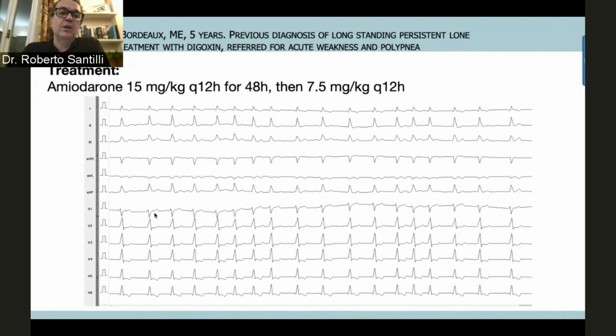So in this dog, we know he has severe interventricular dyssynchrony due to a fibrotic or fibrofatty process. We don't know because we couldn't do any biopsy in this dog, but the conduction along the left ventricle is delayed. And so you have a drop in cardiac output, a drop in stroke volume, and an increase in sympathetic drive.